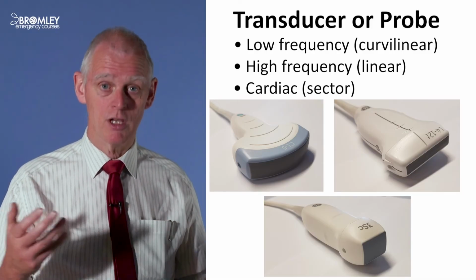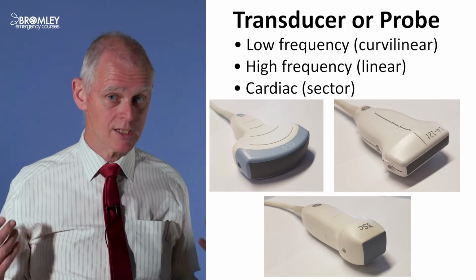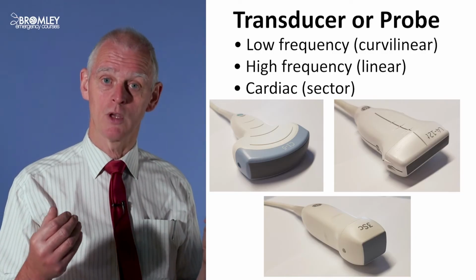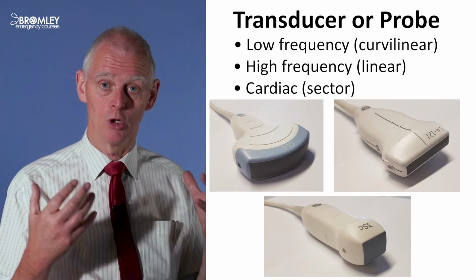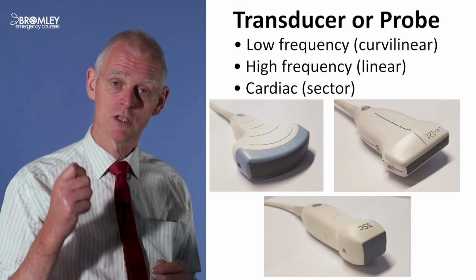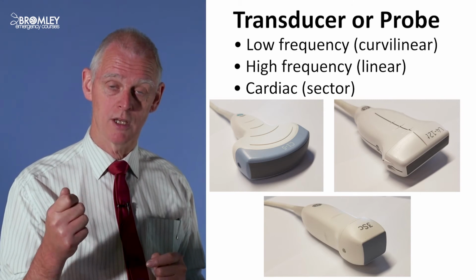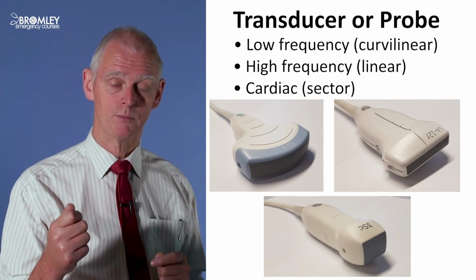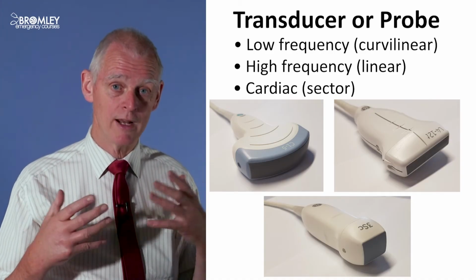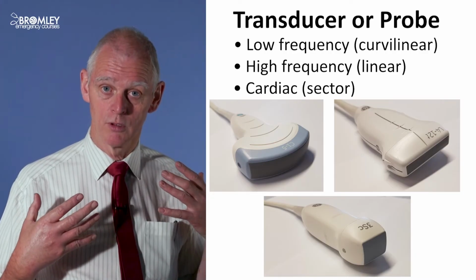Now, up until that time, we didn't have any way of looking inside the heart of a living person. We could take a history, we could listen with a stethoscope, we could do an ECG, we could do a chest x-ray and get the shape of the heart. But there wasn't any way that we could look inside the heart. We couldn't look at the aortic valve or the mitral valve. But here was a technology which had the promise of showing us into the heart and assessing the heart in detail. But the problem is that the heart is surrounded by structures that you can't scan through.